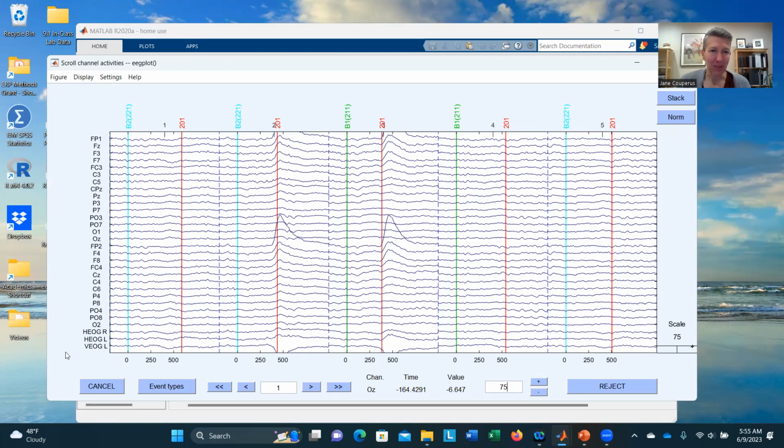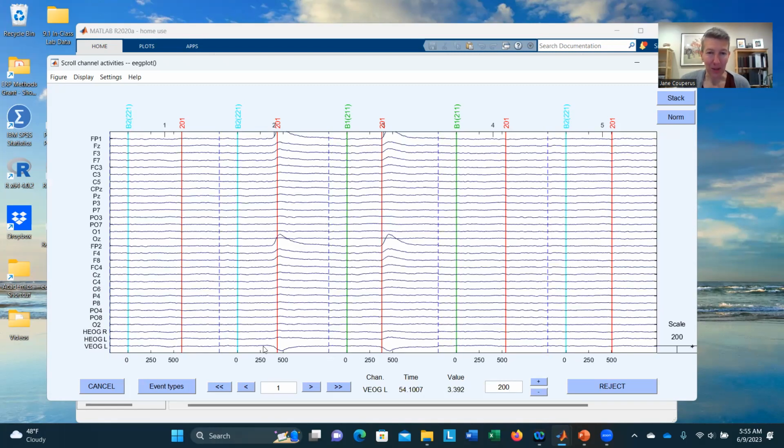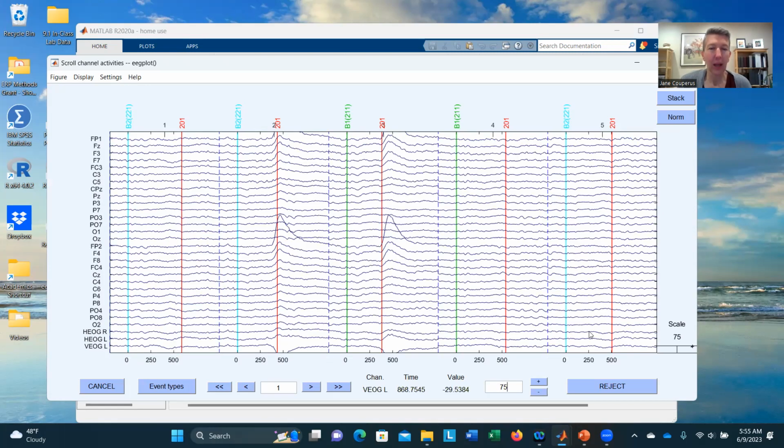And if I look at the vertical lower down here, it goes down. If I change the scale real quick, so everything's smaller, you can see they're kind of mirrors of each other, right? So that's going to be a blink. I want to mark that. And so I just click on it to mark it and it will turn it yellow. So I know it's marked.